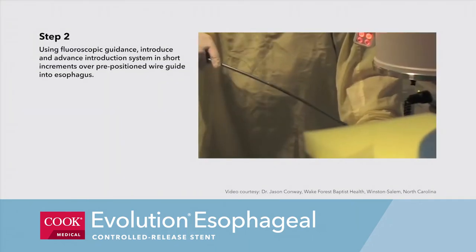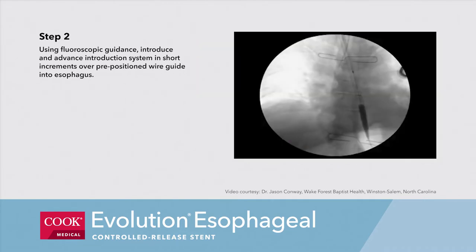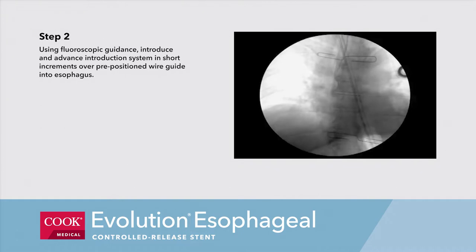Step 2. Using fluoroscopic guidance, introduce and advance the introduction system in short increments over a pre-positioned wire guide into the esophagus.